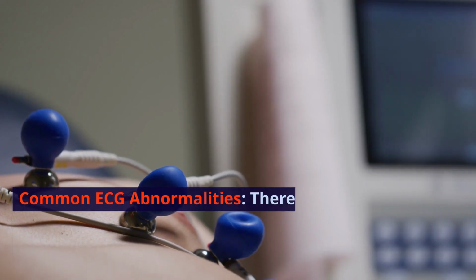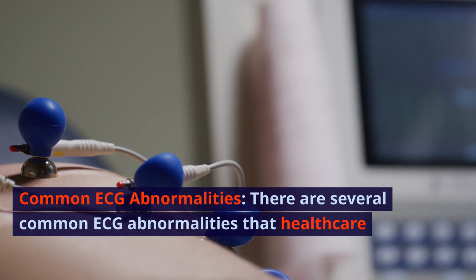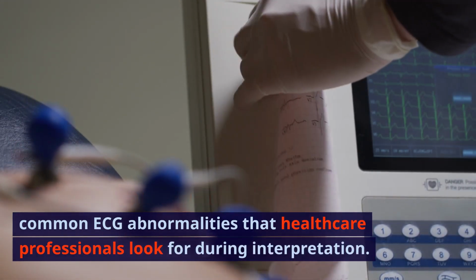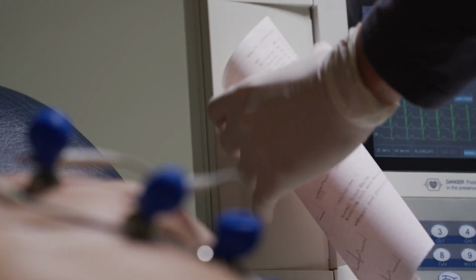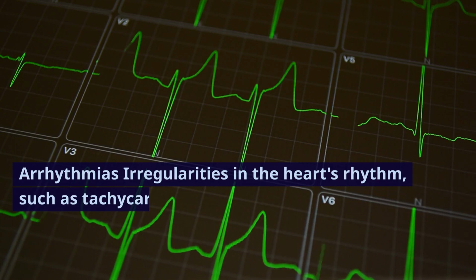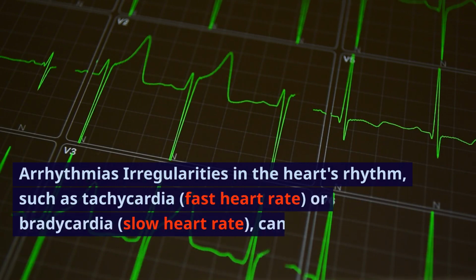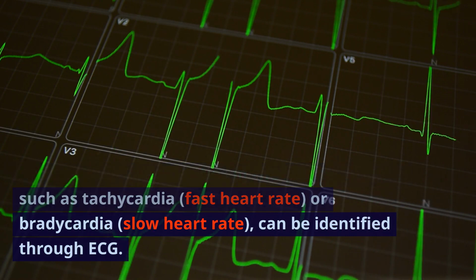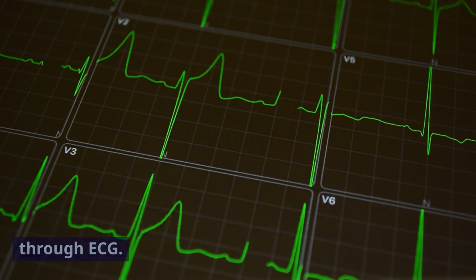Common ECG abnormalities. There are several common ECG abnormalities that healthcare professionals look for during interpretation. These include: 1. Arrhythmias, irregularities in the heart's rhythm, such as tachycardia, fast heart rate, or bradycardia, slow heart rate, can be identified through ECG.